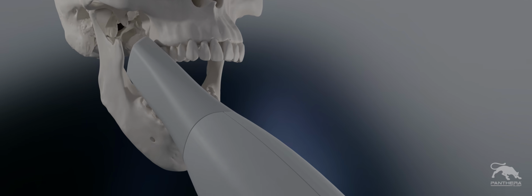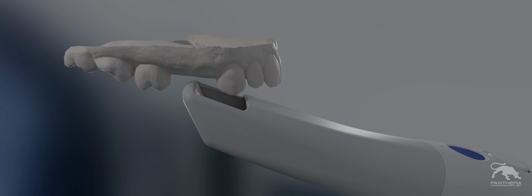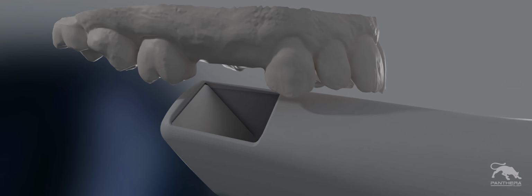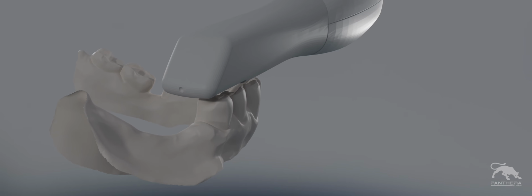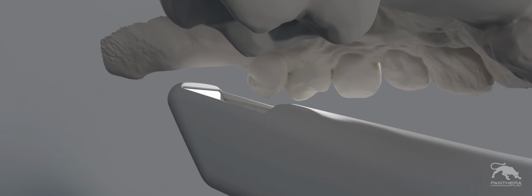If an edentulous area is present, try to take as much detail as possible of the distal and mesial of the teeth adjacent to the edentulous area, as well as the gum as the camera passes. If there are free saddles behind the last tooth of a sextant, make sure to capture up to the retromolar cushion in the lower arch, or up to the maxillary tuberosity if it's in the upper arch.